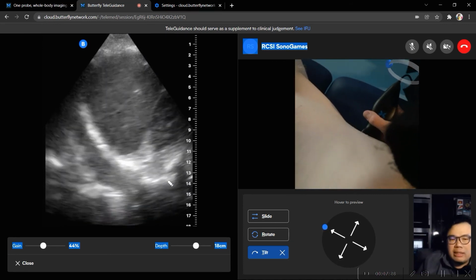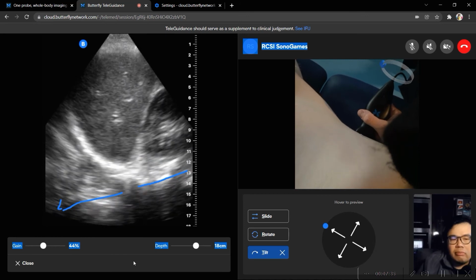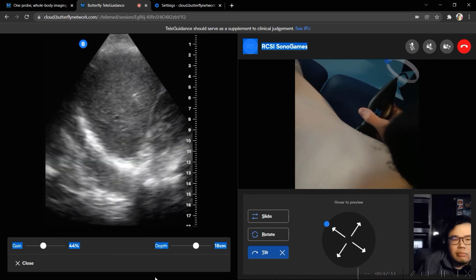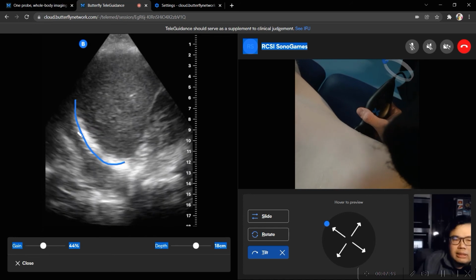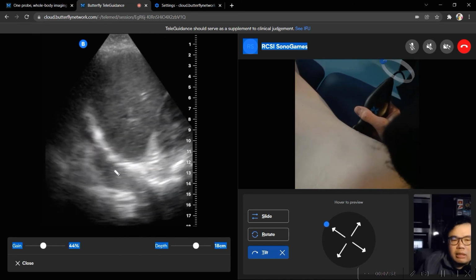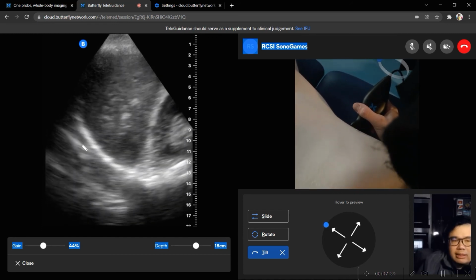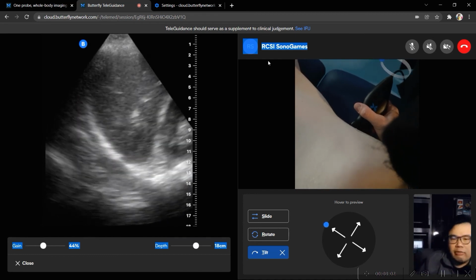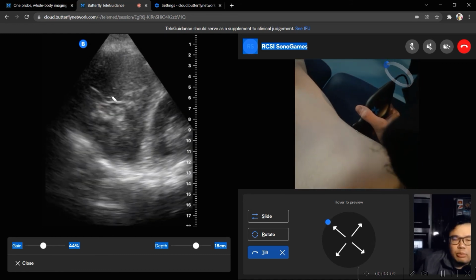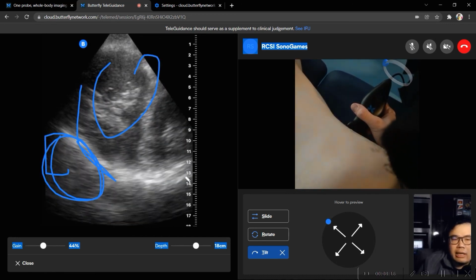Perfect. So applying the same principle, do we see the spine going above? No. What's all this stuff here? Bowel? Okay, so this is the diaphragm. So this would be lung, thorax. This is abdomen. So that's all lung. But essentially this is a mirror image. So it's the ultrasound fooling itself, or fooling you, in this instance, because it's thinking that it's projecting this image over here. It's the way that you have the angle for the spleen.